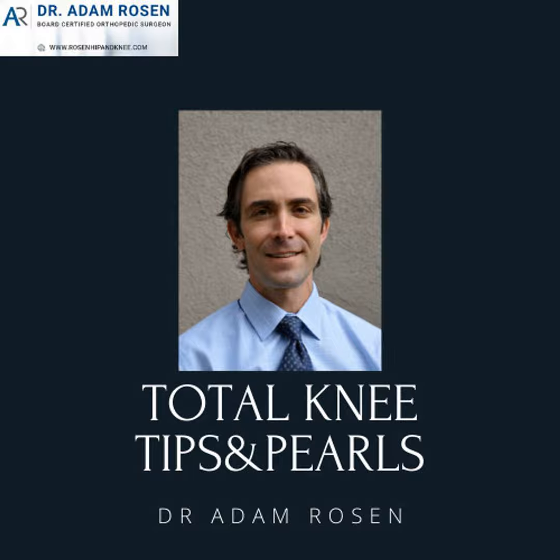I start up top, and I start medially typically. I'll do my anterior flange, making sure I come across the anterior flange as far as I can. Then I go to the anterior chamfer, and then to the distal aspect on the medial side. This is where you need to know your implant. Is there a peg there that you're going to hit? If there is, you need to work around that. And then the posterior chamfer. The difficult thing is really getting the posterior cut between that and the implant.